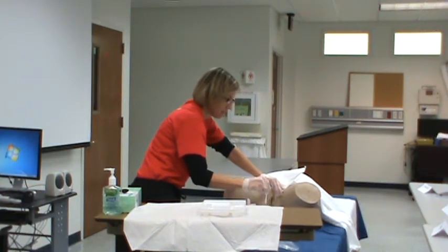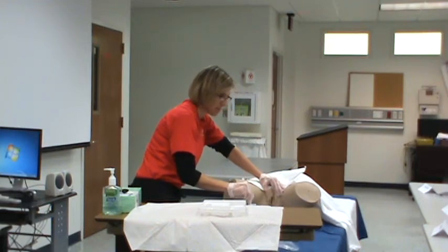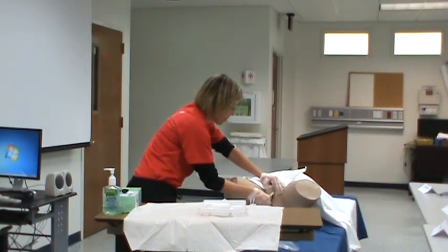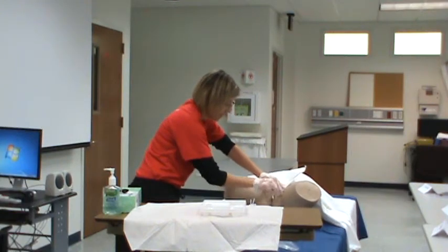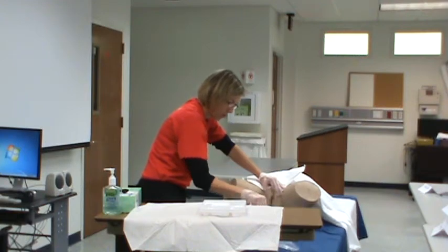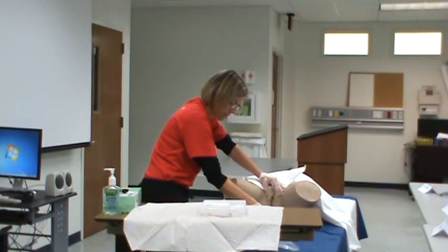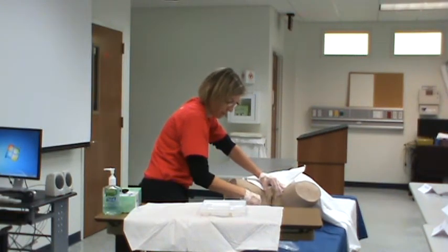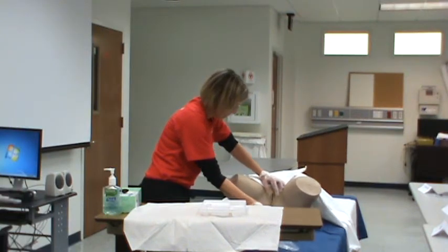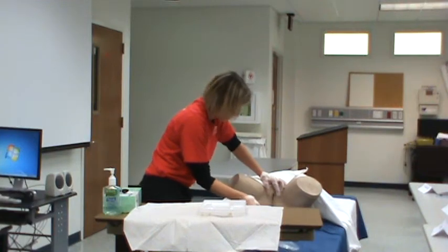Now let's say I got dropsies and went, oh, well look, I still have my emergency pack. So I'm like, okay, well good. I made a little mess there, but that's all right. And then you go right down the middle. And then get rid of that. All right, I don't need that. And now I pick up my catheter. Actually, don't need that either, so let's get that out of the way. My catheter, and get ready.